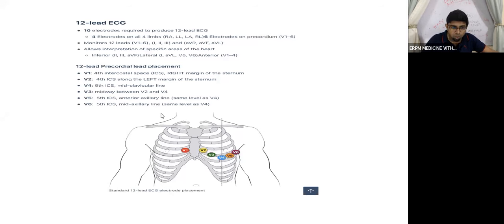So how do the 10 electrodes bring the 12 lead ECG? There comes the physics. The electrical activity of the heart, if you tell in terms of physics, is a force, F. You might have learned this in the good old days in physics class, advanced level. Maybe the kids may be more aware. So these forces are vectors.